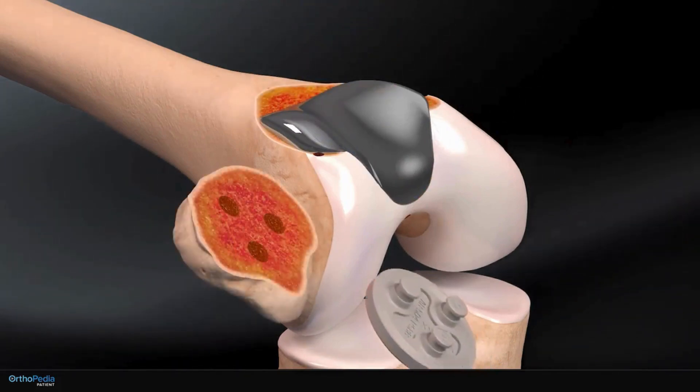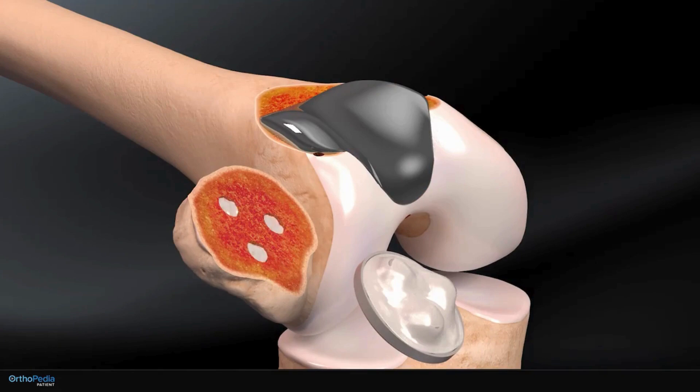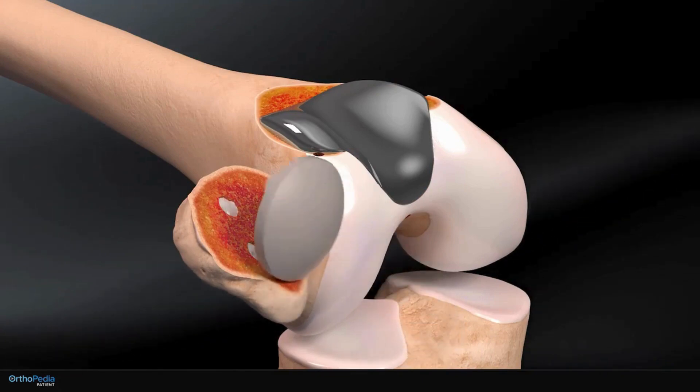The plastic implant for the kneecap is also coated in bone cement and secured to the prepared surface of the kneecap.